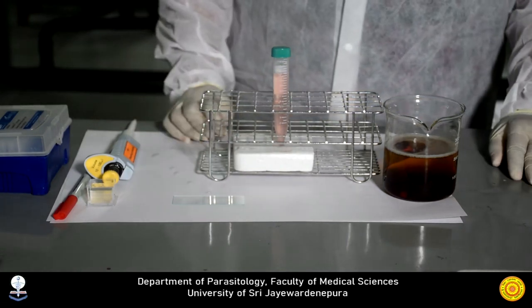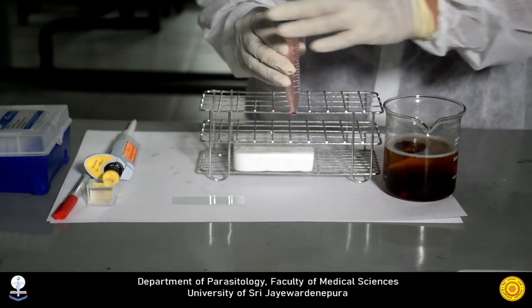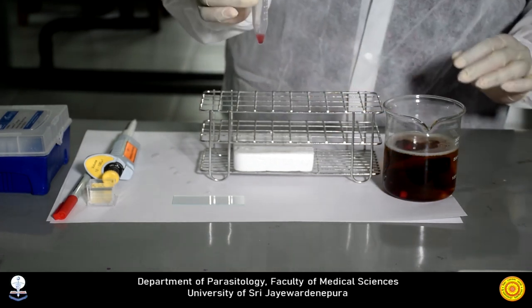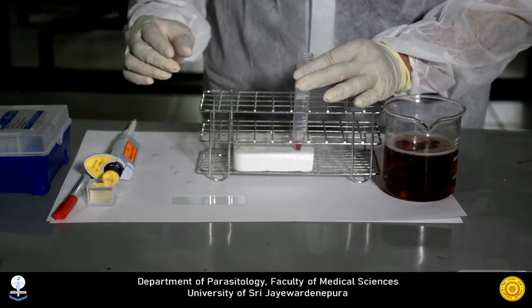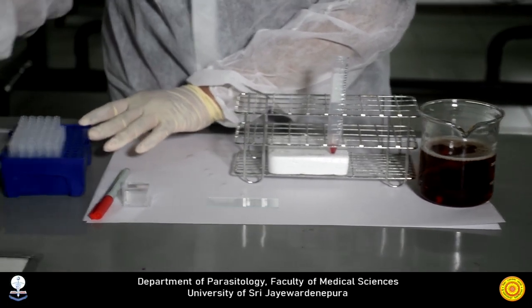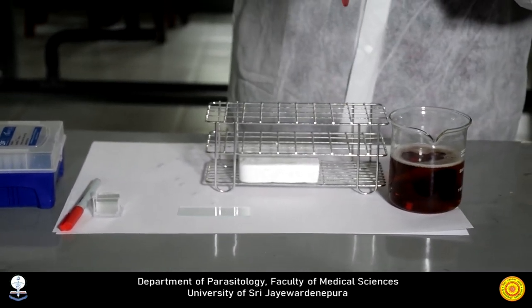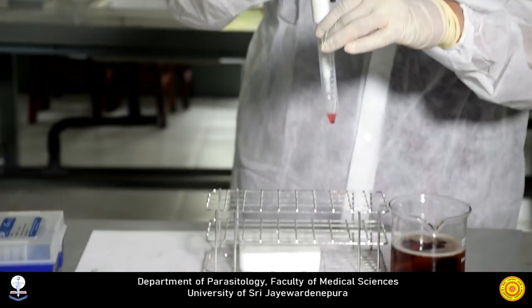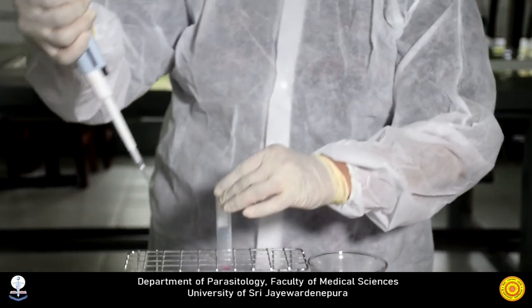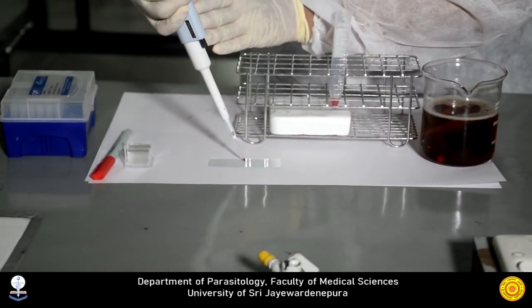Now this is after centrifugation. Now discard the supernatant. Take a drop of the deposit from the bottom of the centrifugation tube onto a glass slide, and cover with a cover slip.